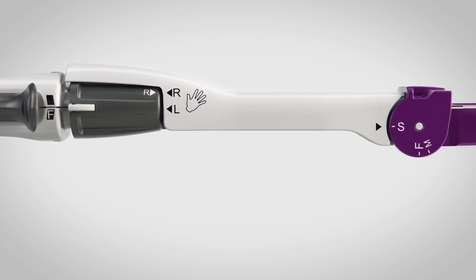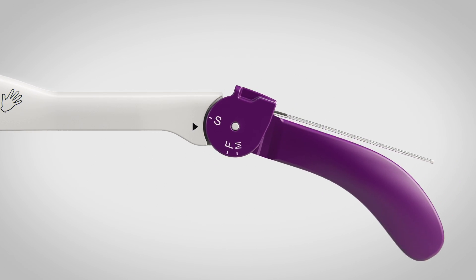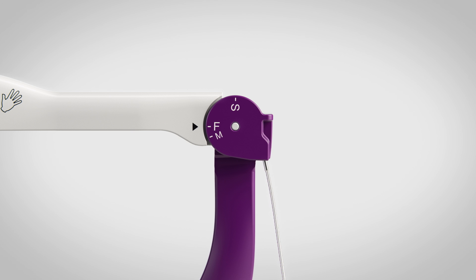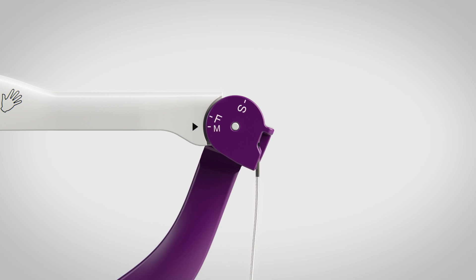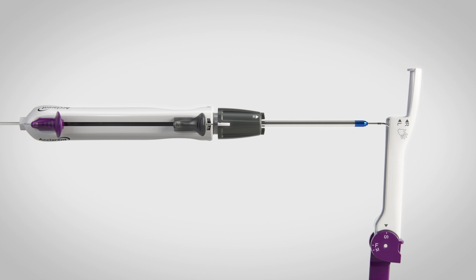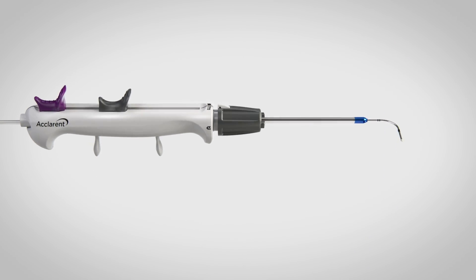Shape the seeker-like tip for the desired sinus so that the black arrow on the angle selection tool aligns with the white marking F for frontal or M for maxillary. Once shaped, gently remove the device from the angle selection tool. Push the gray wire slider all the way back to retract the wire.